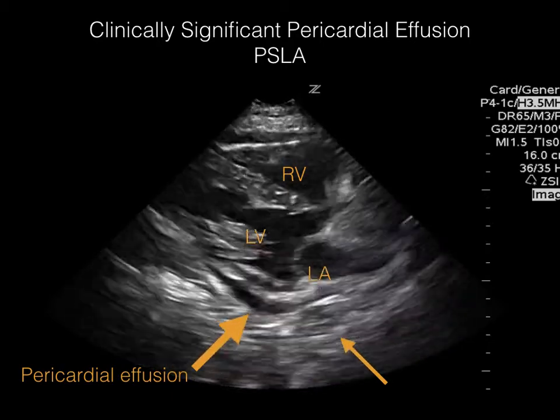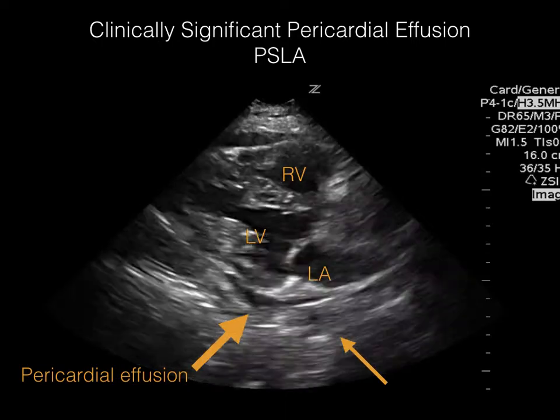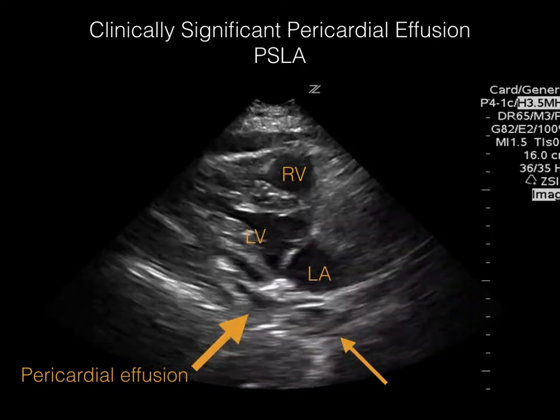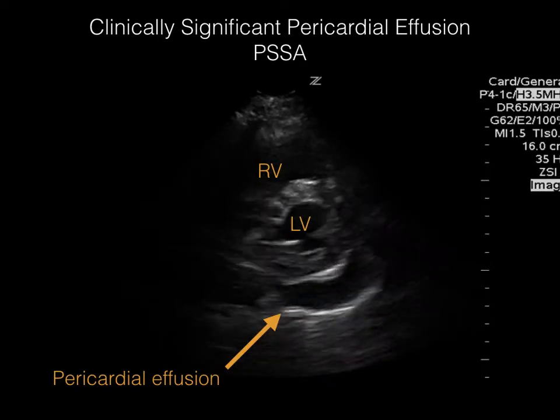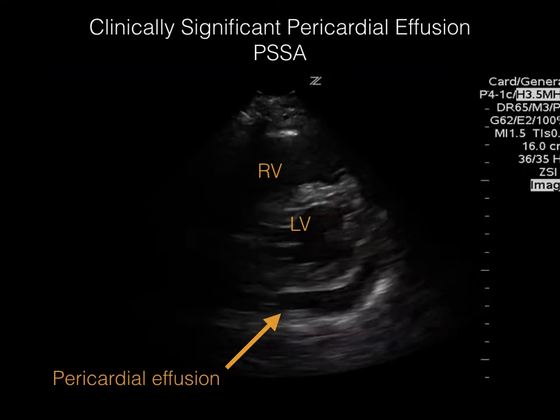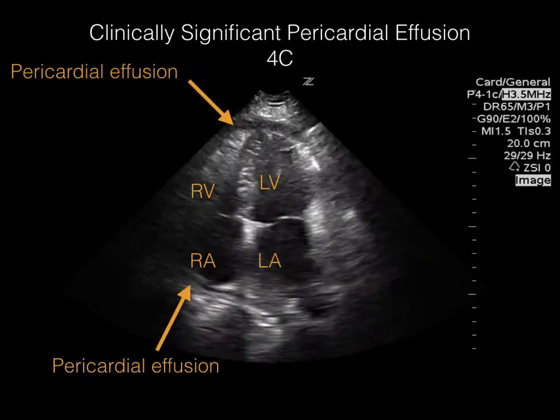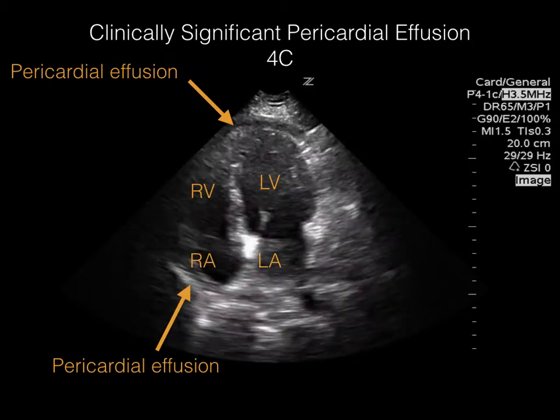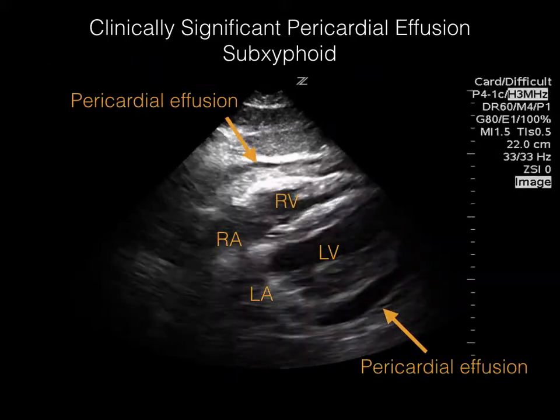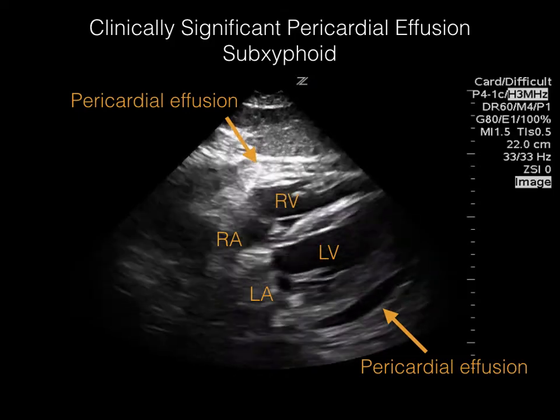This parasternal long axis view shows a pericardial effusion that appears as a black stripe, pointed by the large arrow, between the left ventricle and the descending aorta shown by the smaller arrow — a circular black structure posterior to the heart. In this parasternal short axis view, we see the same black stripe posterior to the left ventricular wall. In this four chambers view, we can identify a pericardial effusion at the apex and at the base of the right atrium. This subcostal view is a great view to look for a pericardial effusion — we can see it both anteriorly and posteriorly in this clip.